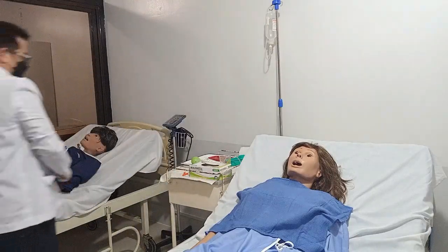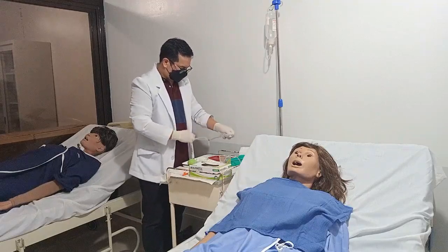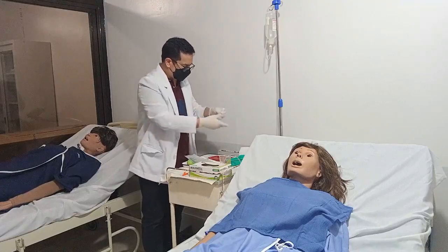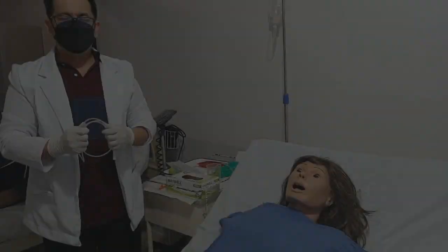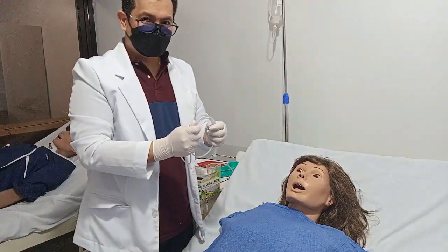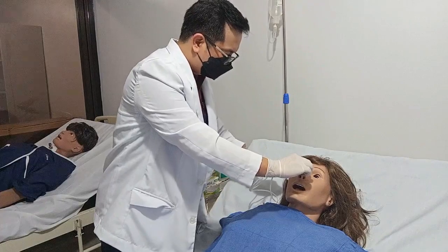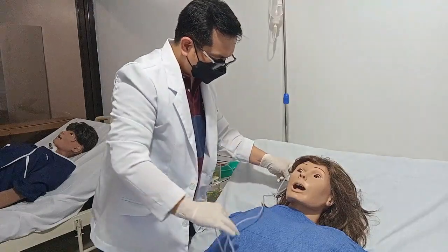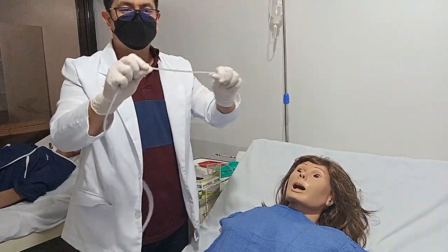Prepare the tube. Determine how far to insert it by using the tube to mark off the distance from the tip of the client's nose to the tip of the earlobe, and then from the tip of the earlobe to the tip of the xiphoid process. Mark this length with an adhesive tape if the tube does not have any markings.